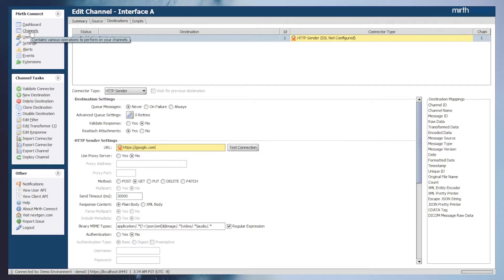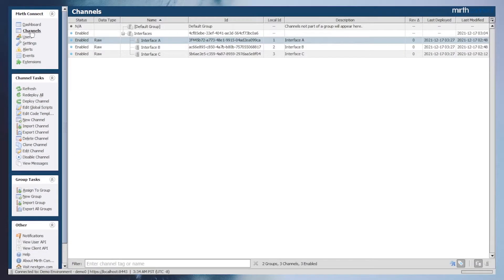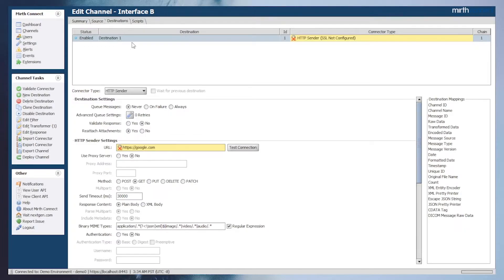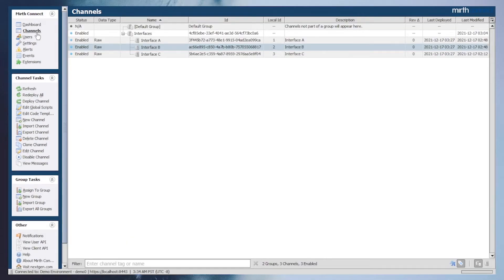Hopping over to interface B, we can see the same string value used for the URL. In this simple example using two interfaces, it would be easy enough to go into both interfaces and update the URL value manually if the URL needed to be changed. But this becomes more difficult to maintain as your list of interfaces grows.